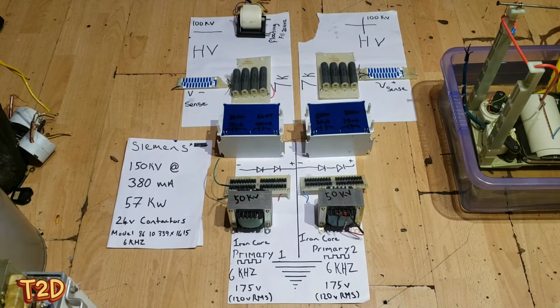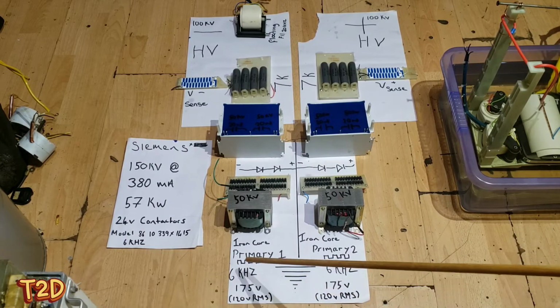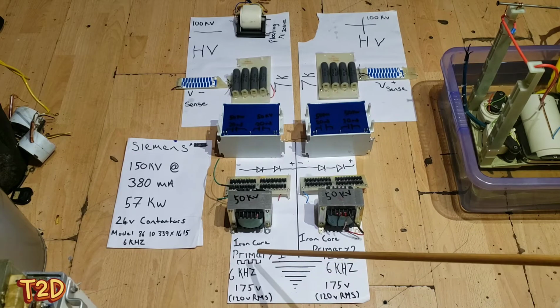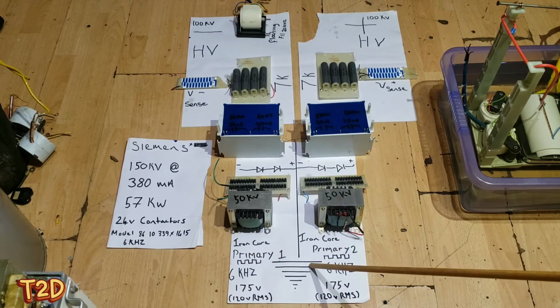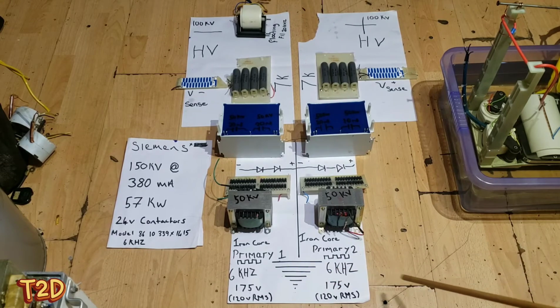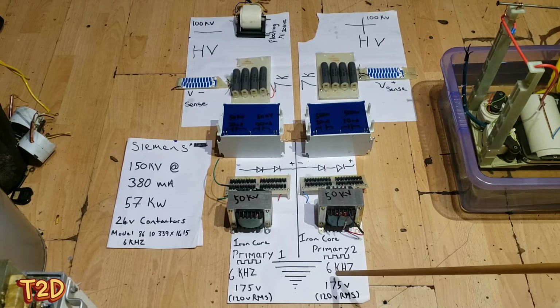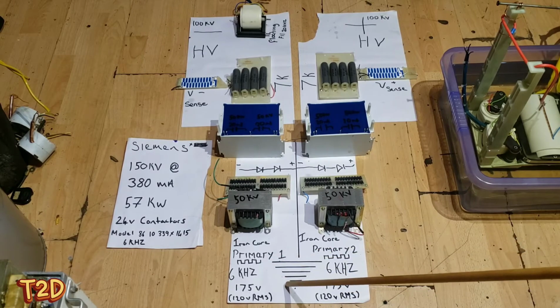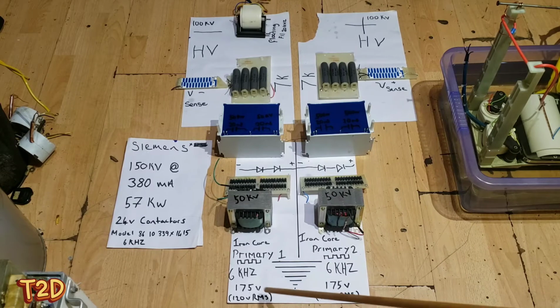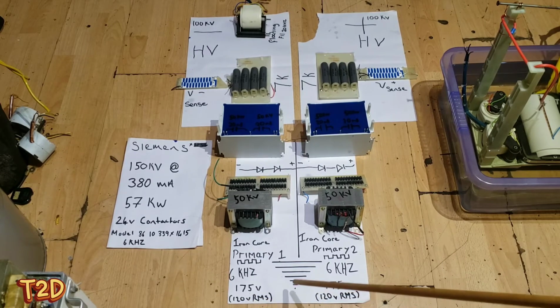Now with most of these transformers, and the Siemens is no exception here, we have access to both of the primaries on the outside of the tank. So we could either run these in series or parallel, depending on whether we want to use a half bridge or full bridge to drive this thing. Obviously, if we want to use a half bridge, we put them in parallel, and if we want to use a full bridge, we put the primaries in series. As you can see, they're geared up for 120 volts RMS, which is half of the mains voltage here in the UK.